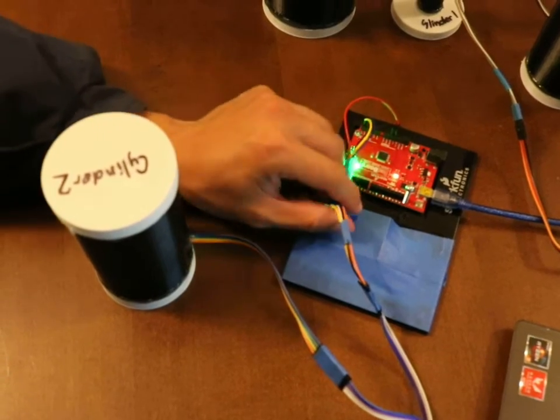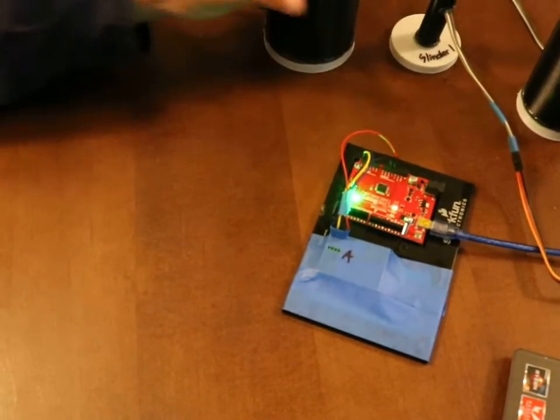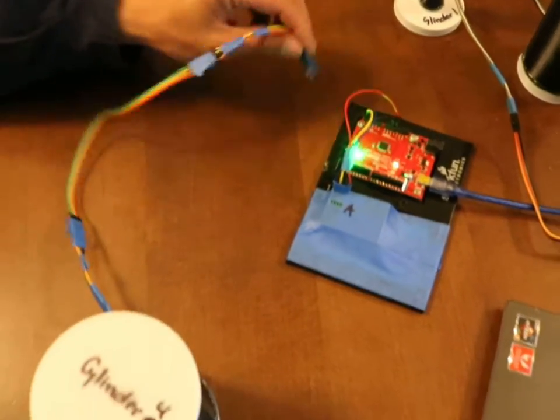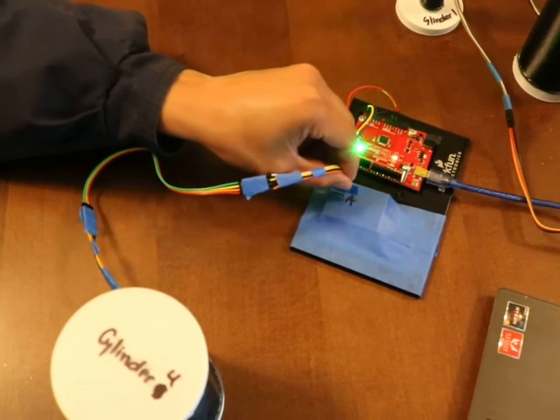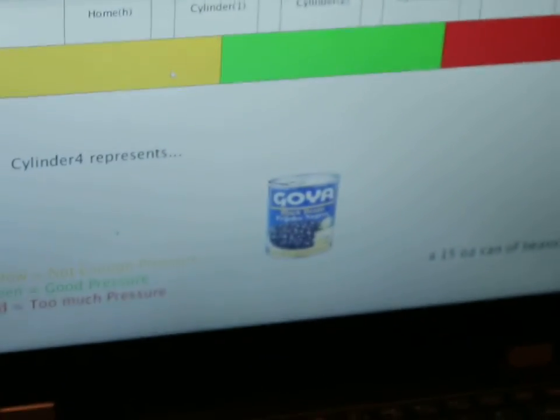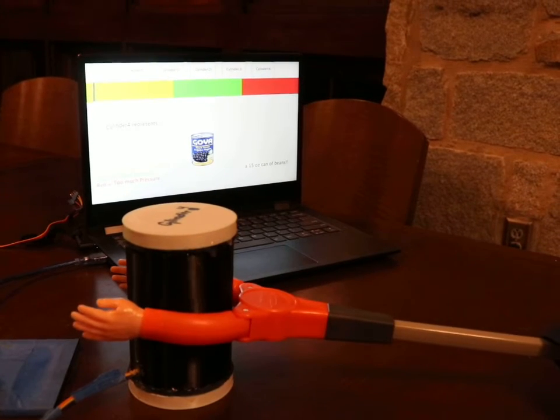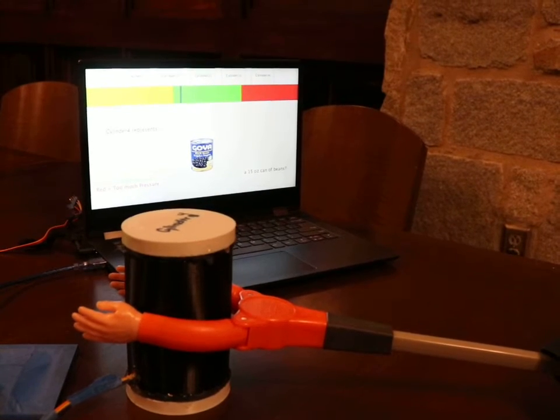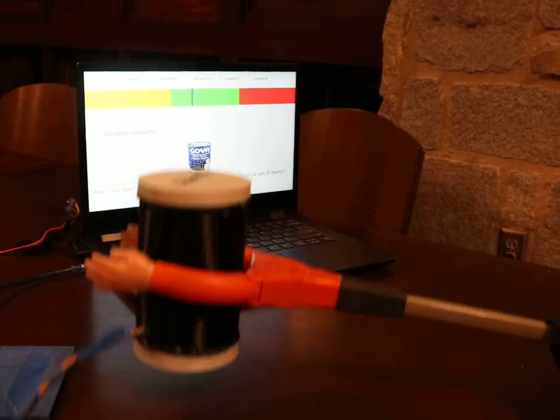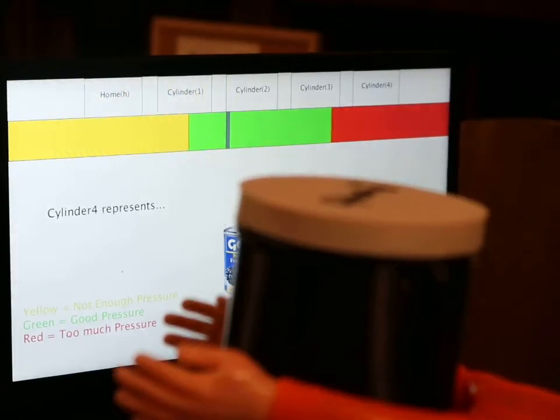To train on a new cylinder, we will first begin by unplugging the current cylinder and then plugging in the new cylinder while matching the A's to the A's. We will then choose the corresponding number key that matches the cylinder number. Once this has been finished, using your prosthesis, grip the item until it gets into the green zone, and once you feel comfortable, you can pick up the item, and then once you feel like you've practiced enough, you can place the item back down.